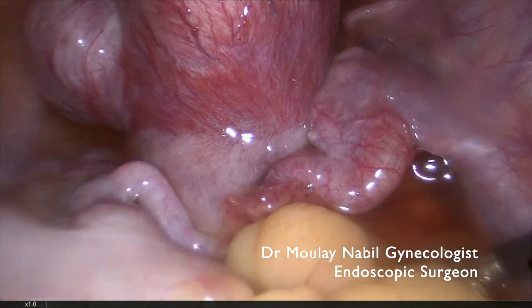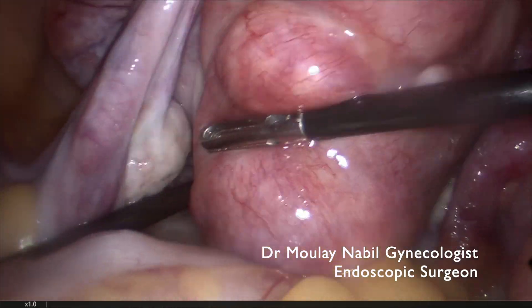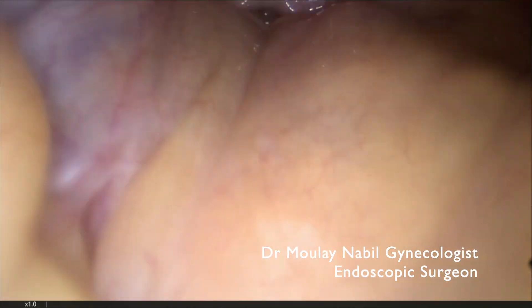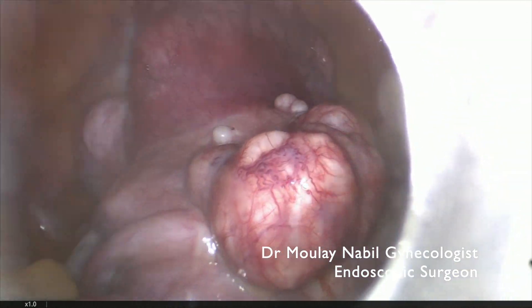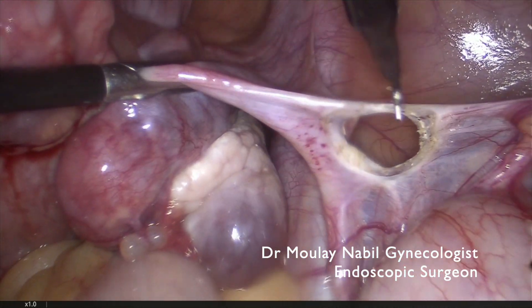This is a patient with multiple myomas with pregnancy desire. The first step of the procedure was to do a hysteroscopic exam to confirm there is no myoma inside the uterine cavity.